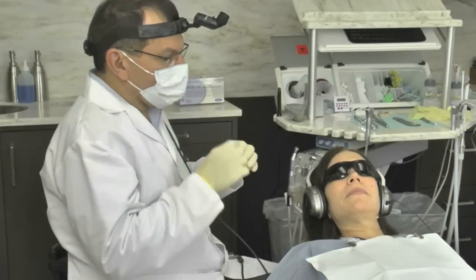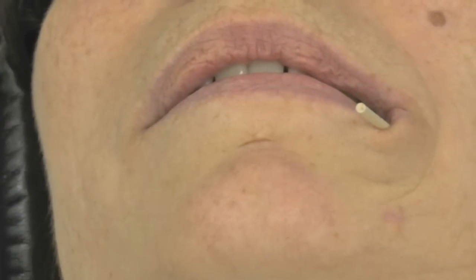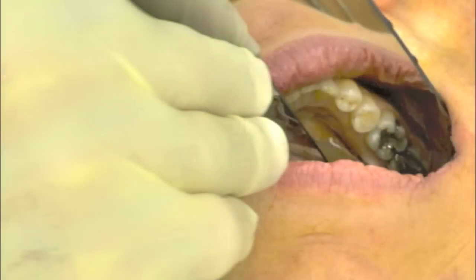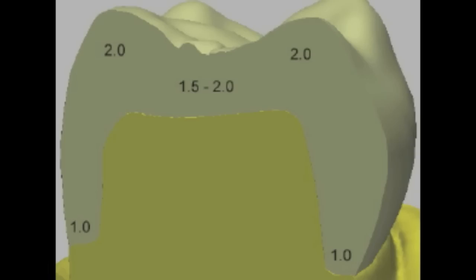We do everything the way we usually do. Make sure the patient is nice and numb, taking our time to give a slow lower block. We're replacing these two old amalgams that have some marginal decay. Everything is done the way we normally would do. We pay attention to the guidelines for all ceramic restorations where there's sufficient thickness of the material and no sharp line angles.